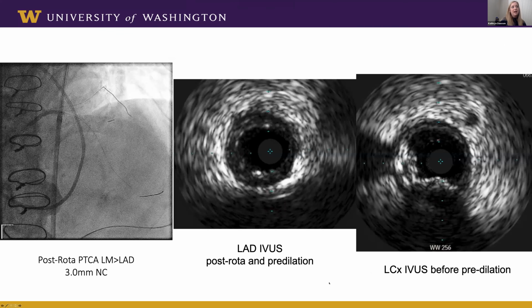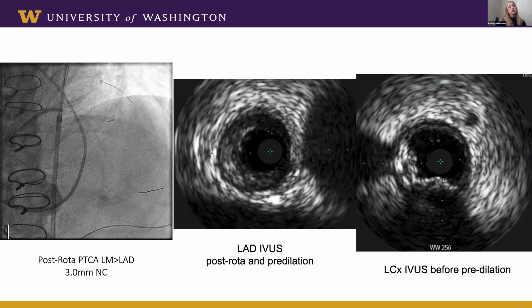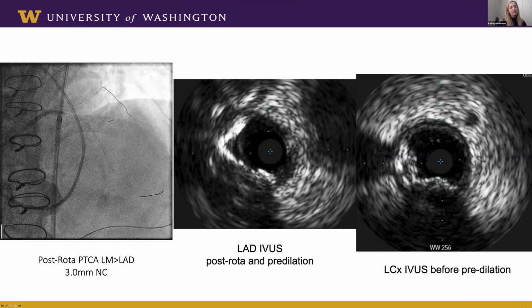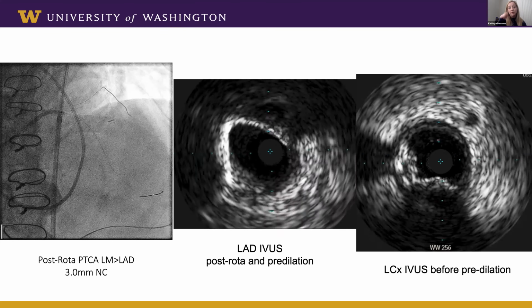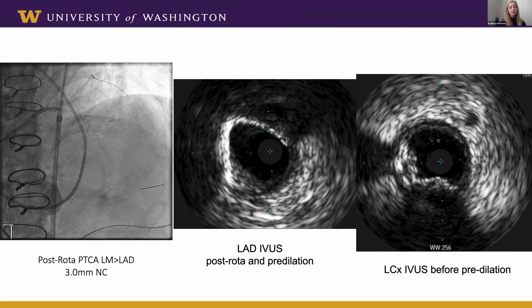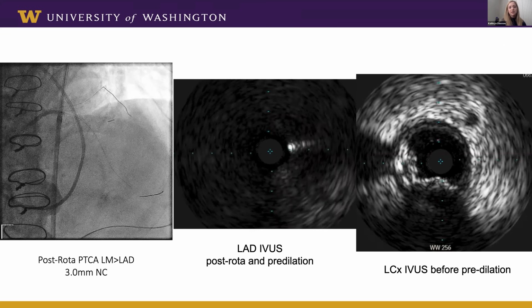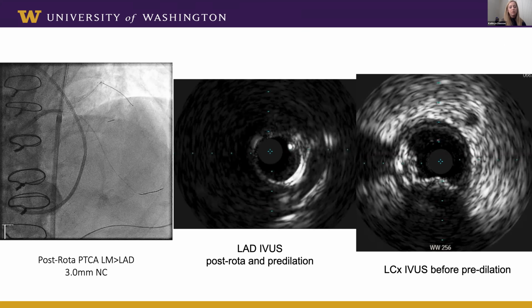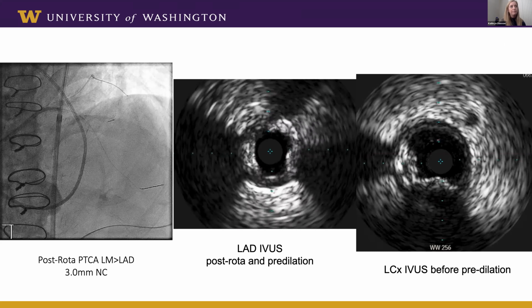For the left main, we did not capture it, but we actually did initially try to put an IVUS catheter down the LAD, but it wouldn't pass beyond the proximal segment where the most calcified lesion was. So we did do upfront rotational atherectomy with a 1.75 burr, went through two passes, it passed pretty easily. And then we post-dilated with a 3.0 NC from the left main into the LAD.